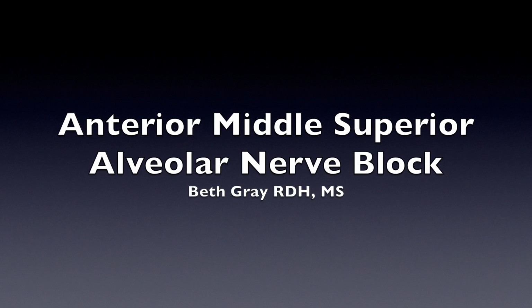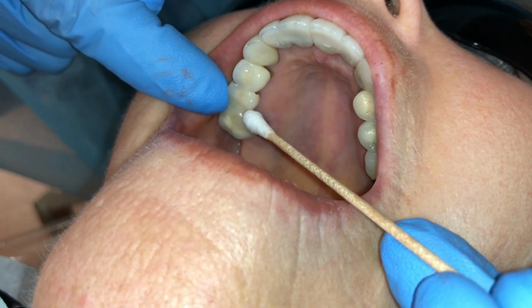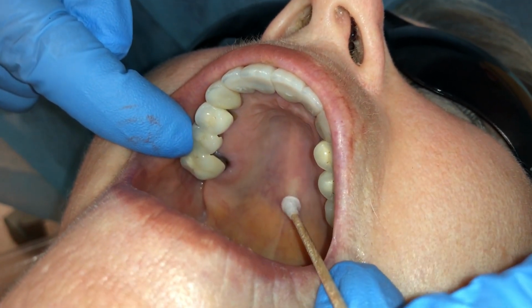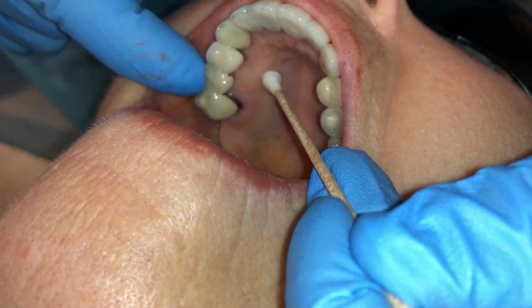Anterior middle superior alveolar nerve block is indicated for pain management from the central incisors to the premolars, and palatal tissue from the midline to the molars, minus the lip. Intraoral landmarks include the midline palatine suture and the premolars.